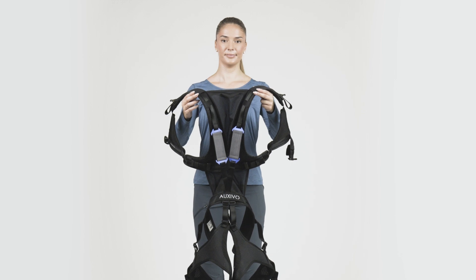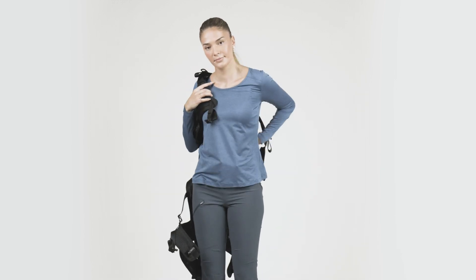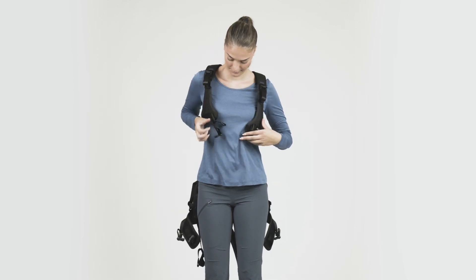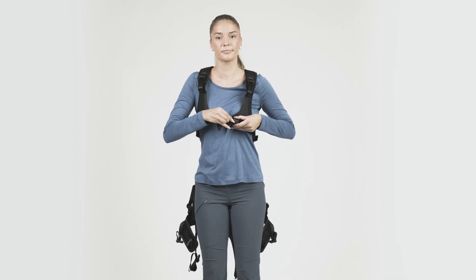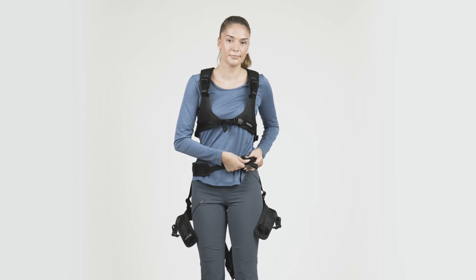Welcome to the LiftSuit Video Manual. This video shows how to use the Auxivo LiftSuit Exoskeleton. Please familiarize yourself with the LiftSuit's functionality and usage to make sure you can fully take advantage of its numerous benefits.